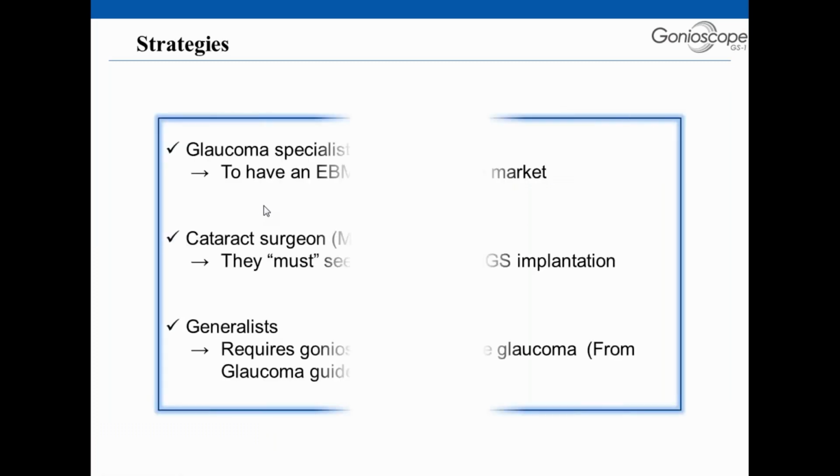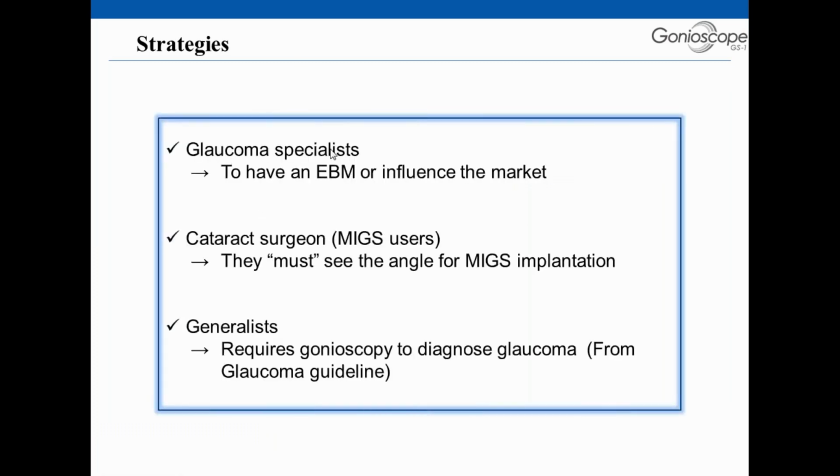And for the strategy, for glaucoma specialists, it is to have EBM, evidence-based medicine, or influence the market. And for the cataract surgeon, a MIGS user, they must see the angle for MIGS implantation. For generalists, it requires gonioscopy to diagnose glaucoma, and this is from the glaucoma guideline.